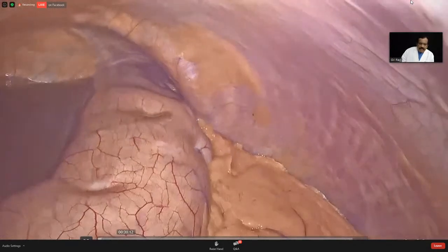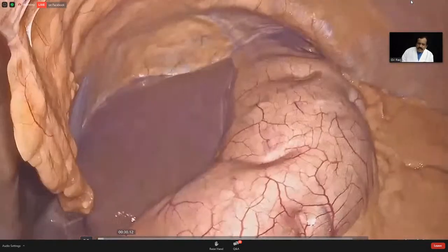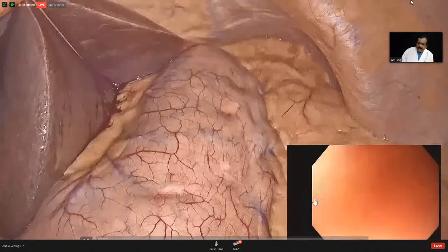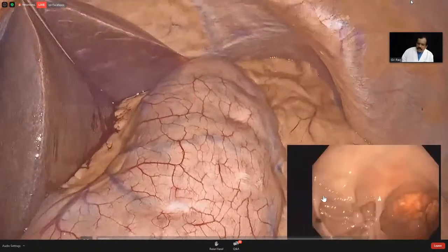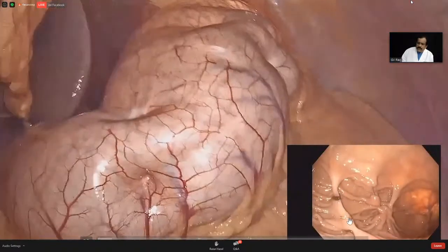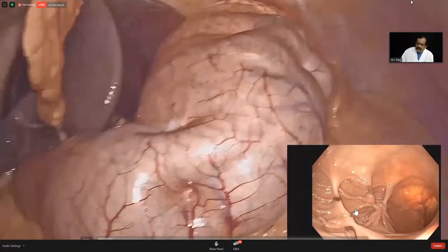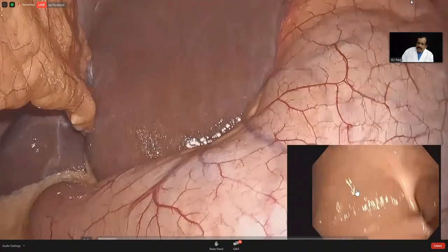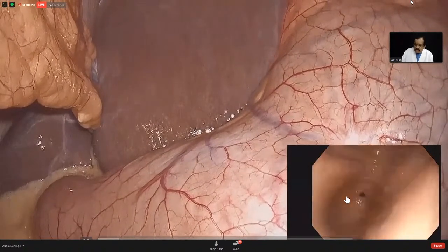You can see this is the video of a patient who underwent the ESG. Only 2 or 3 of these sutures are full thickness sutures. And if you see the luminal side, most of these are just mucosal stitches, which look like some sort of trabeculae that we see in ulcerative colitis patients. So most of them are not full thickness sutures.